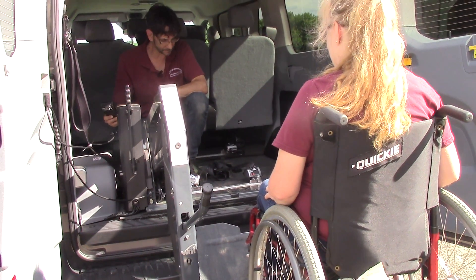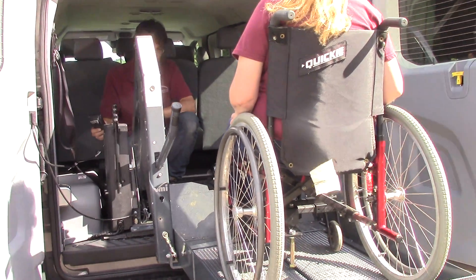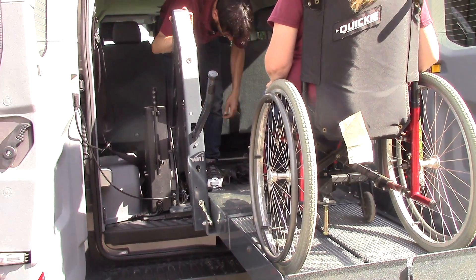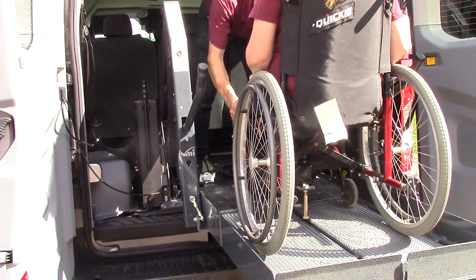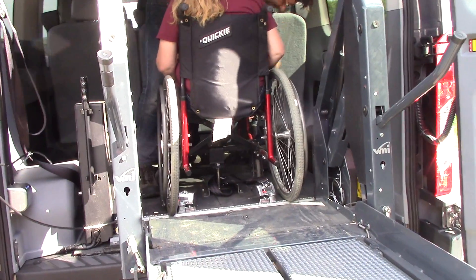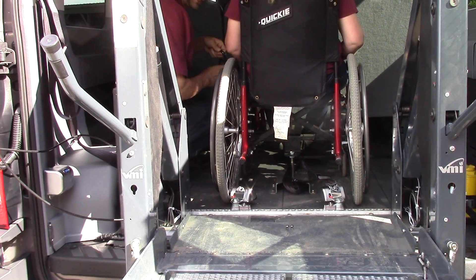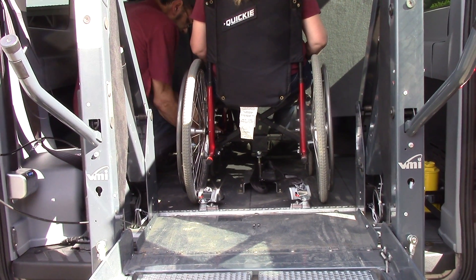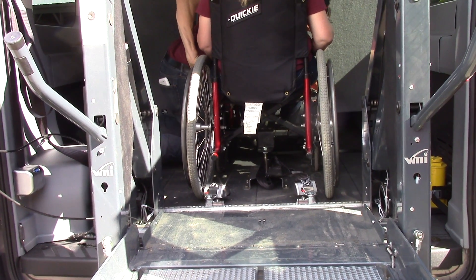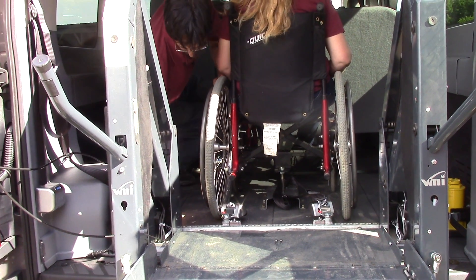Once we get to floor level, we're going to go in right over the tie-downs. You'll notice we have these adjustable tracks which allow you to put the user in right where you want them to be and access the wheelchair brakes, coming in right in this position. Now I'm releasing the tie-down and connecting it to the frame of the wheelchair. Of course these types of manual tie-downs do require a little bit of mobility on the part of the care provider.